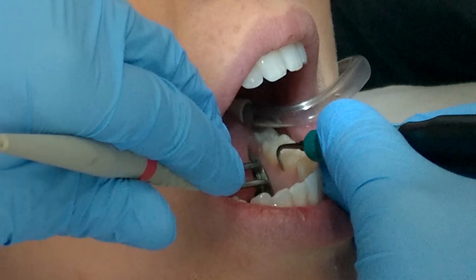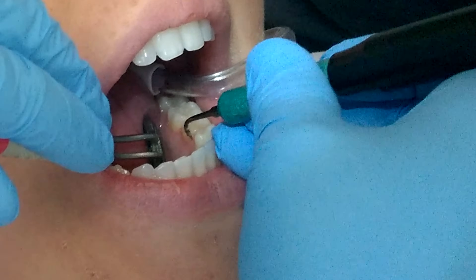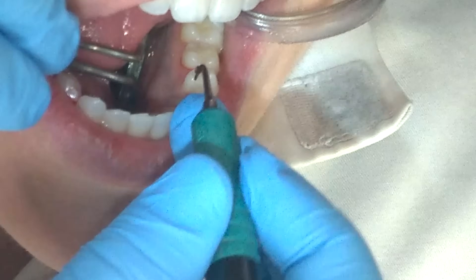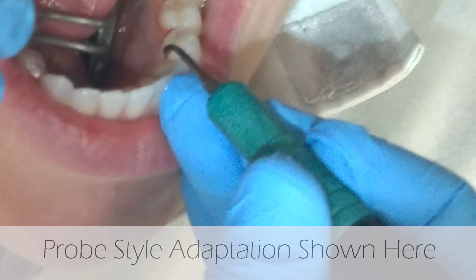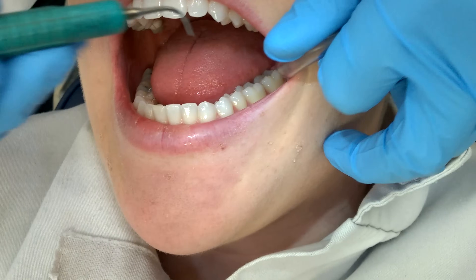It's really important to learn how to feel calculus with your ultrasonic tip, so every so often you can deactivate and use an exploratory-like stroke to evaluate your work. Know as well that your technique for periodontal therapy will be slightly different than your technique on a prophy patient, which is what I'm demonstrating here.